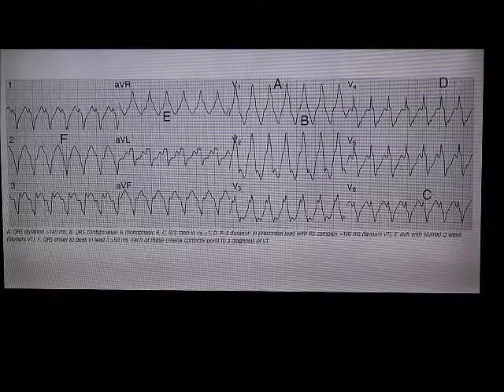Abdulhamid, what do you think? And then a wider complex tachycardia. Okay.